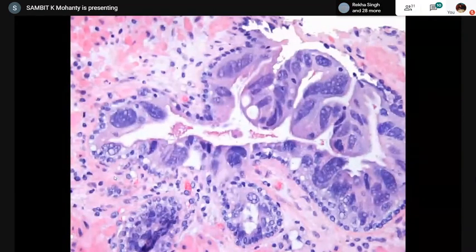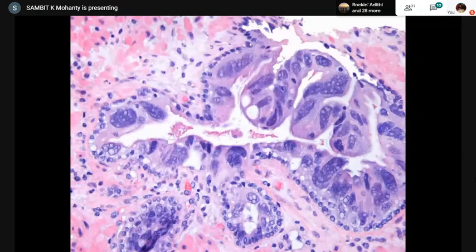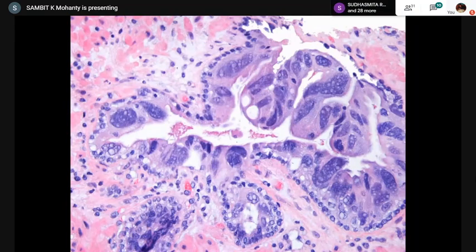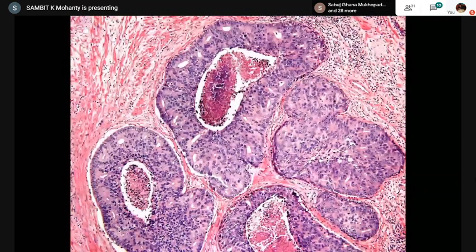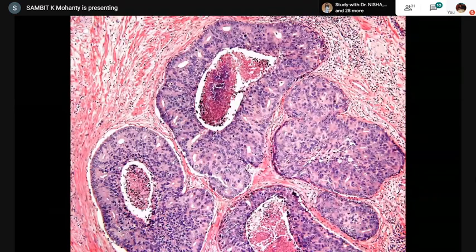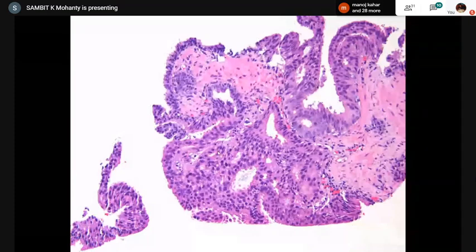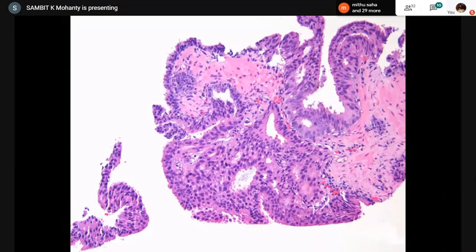In case two, the cells toward the periphery are round, innocent, making a line with their cytoplasm, and the cells at the top have large nuclei with intranuclear vacuolations, variable size, and prominent nucleoli. One area looks like ductal carcinoma in situ — comedo necrosis in the center with lots of cribriform formations. Another area emphasizes no desmoplasia, smooth contour of the cribriform structure with fixed cytoplasm. The cells are not elongated — they're polyhedral to polygonal to cuboidal with good amounts of cytoplasm, so NC ratio is not tremendously high.